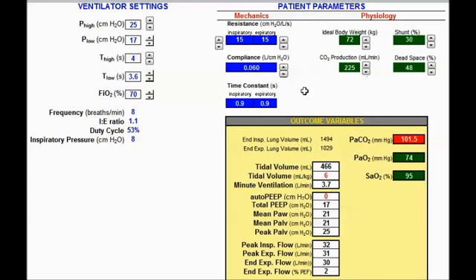One thing that's kind of difficult with this procedure is calculating this time constant. During APRV, some ventilators do this for you, which is nice, that it'll figure your expiratory time constant. However, others you're going to have to mathematically calculate it on your own. But as you notice with this method, it's pretty easy to do, and I can be lung protective on both sides in regards to tidal volume delivery and the generation of very little or zero auto PEEP.